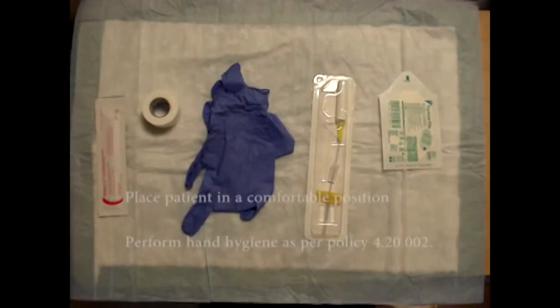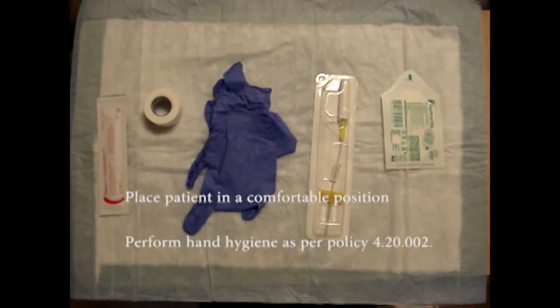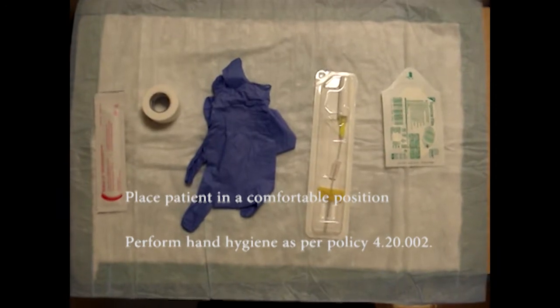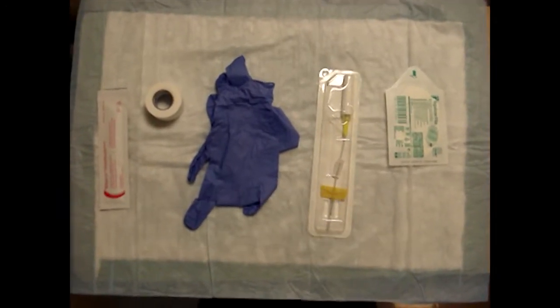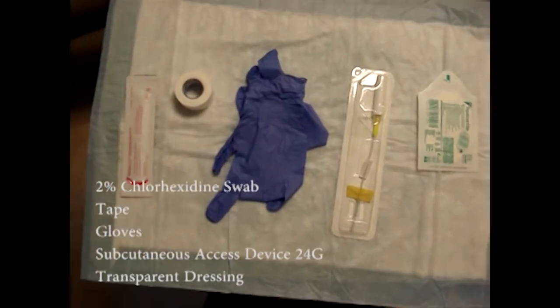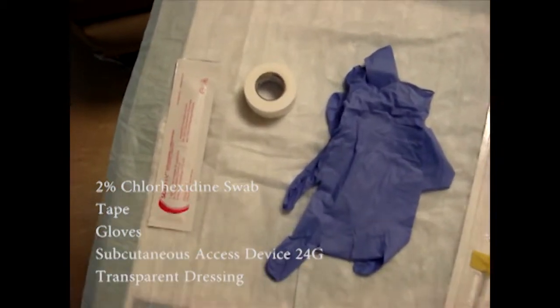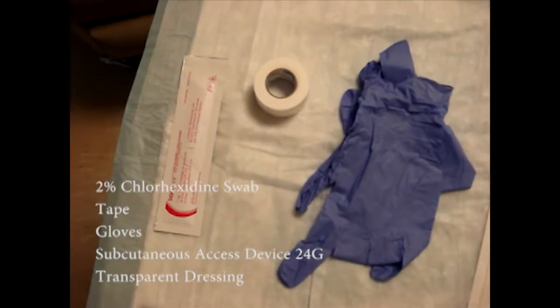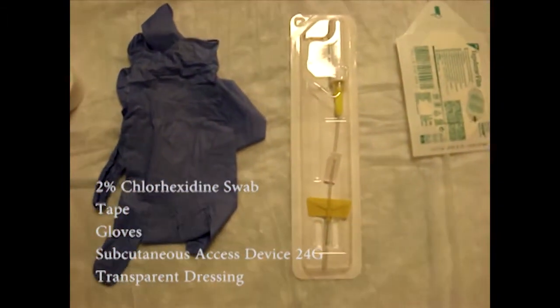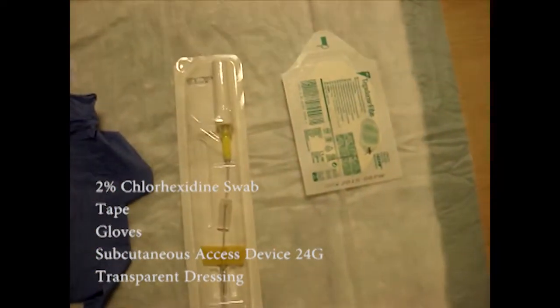Pre-procedure preparation. Place patient in a comfortable position. Perform hand hygiene as per hand hygiene policy. Assemble equipment: 2% chlorhexidine in alcohol swab, tape, gloves, subcutaneous access device, 24 gauge catheter, and transparent dressing.